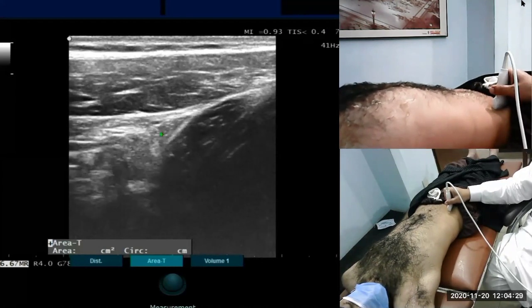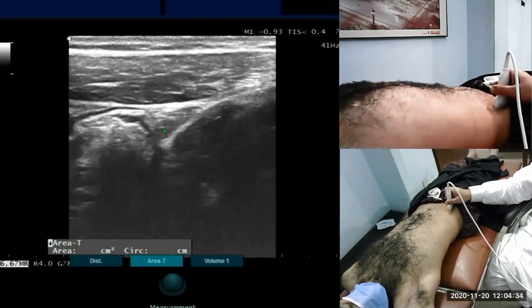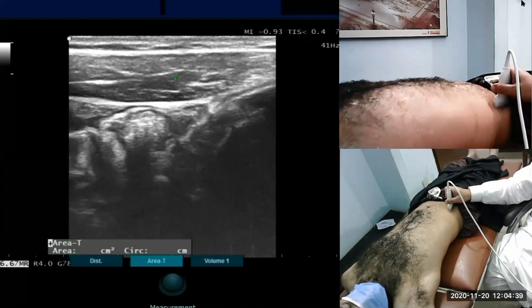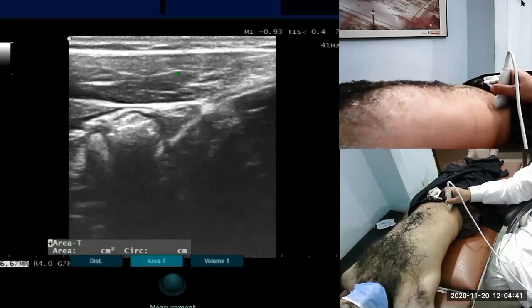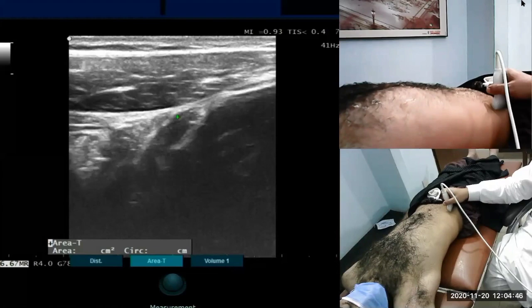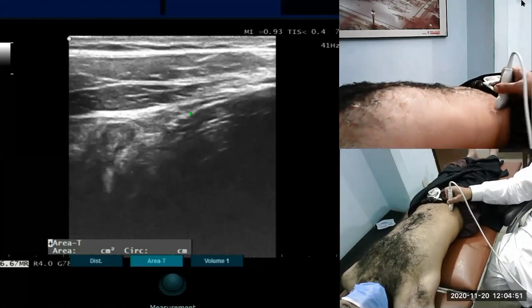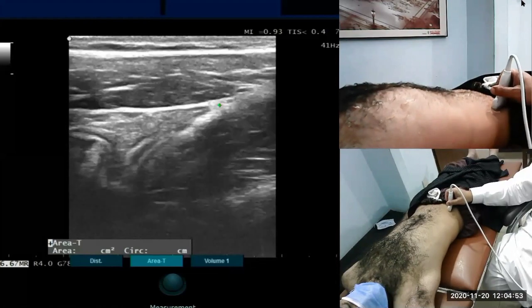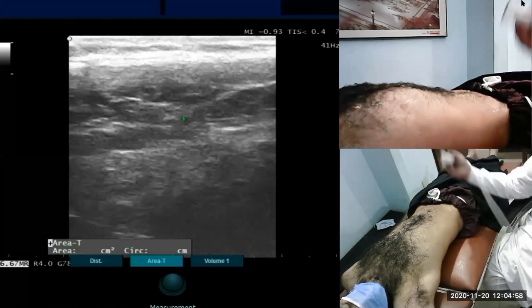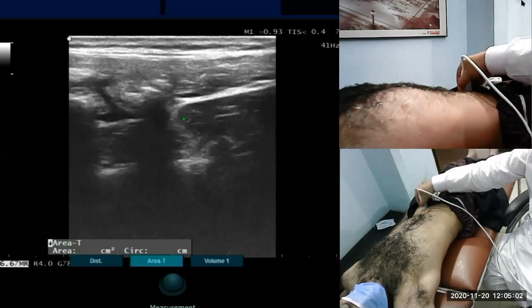There you see this triangle. In this corner, one side is gut, anteriorly is the abdominal wall, posteriorly is the muscle, iliopsoas. Any free fluid in the right iliac fossa, which we quite frequently see, will be seen here, where you have seen this appendix. And then on the left side, the same.